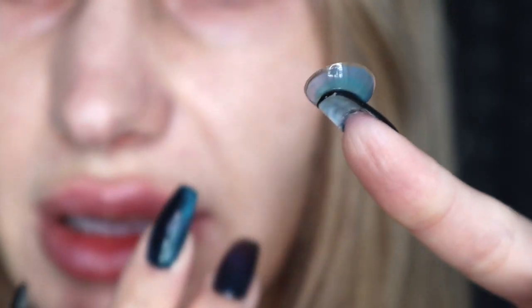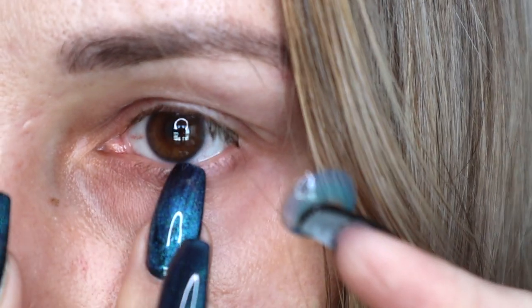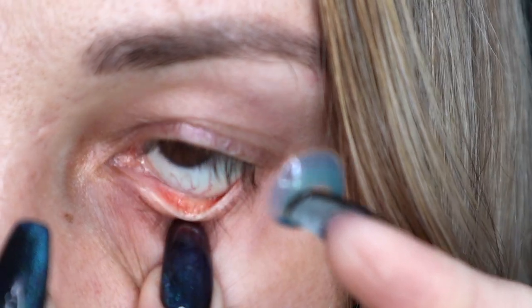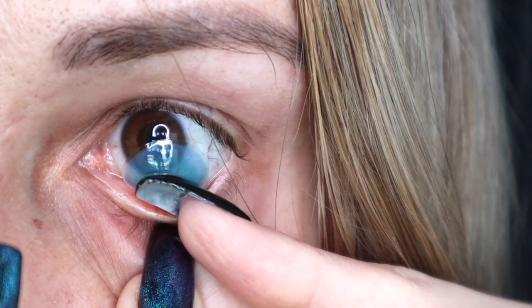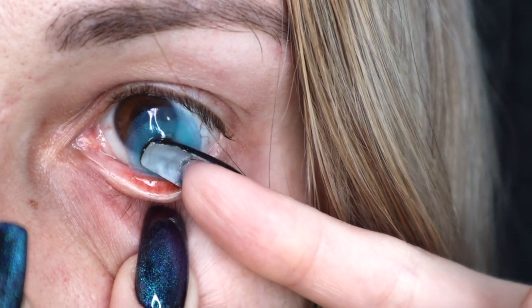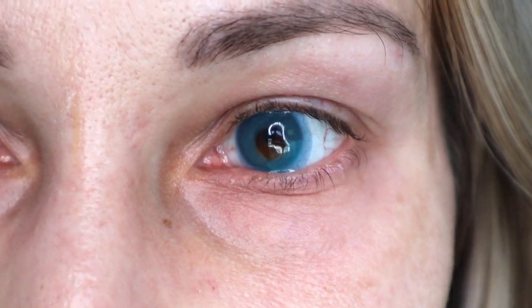With your opposite hand, you kind of just nudge the bottom lash — and there you go! Even though there was a piece of hair in my eye, I still ended up applying it super easily. Just like that — we're going to do the exact same thing on the opposite side.